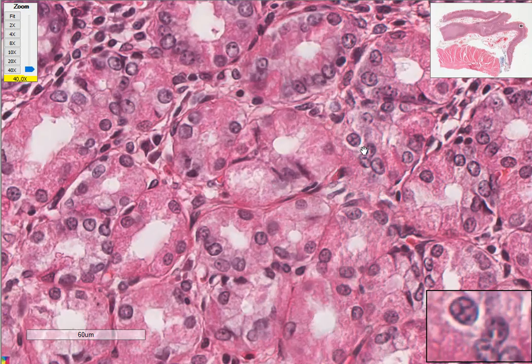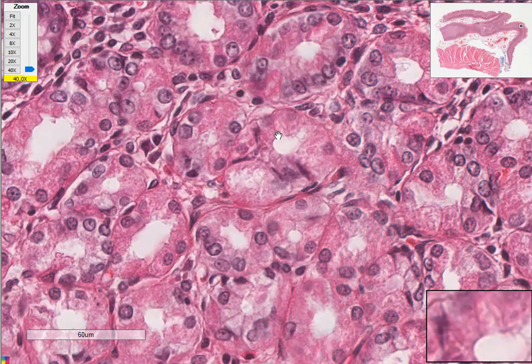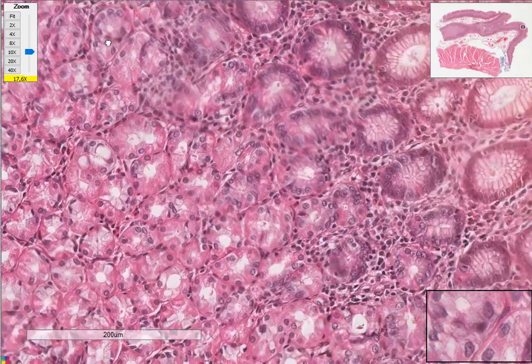And remember, enteroendocrine cells, like I mentioned, produce gastrin, which helps with secretion of the hydrochloric acid and intrinsic factor of the parietal cells, and they also produce CCK, which is cholecystokinin, and substance P, as well as somatostatin and other prostaglandins. Okay, and then just next to the parietal cells, we actually do get chief cells, which are more basophilic. They have a basophilic cytoplasm. Let me just pick up one for you.